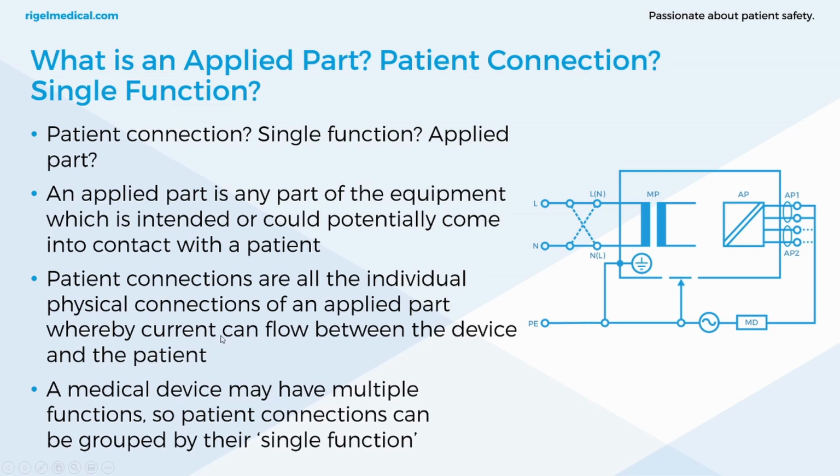So these two are important terms to understand, and it will become more apparent when we look at the testing of other devices such as infusion pumps. So there is a difference between these. The standard explains it in the best way possible, but in our example it explains it even better.